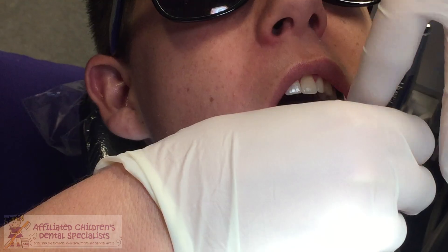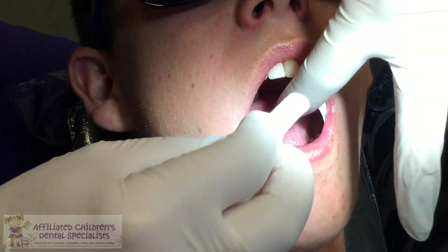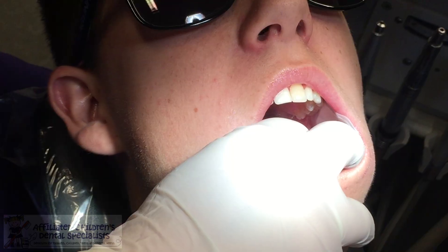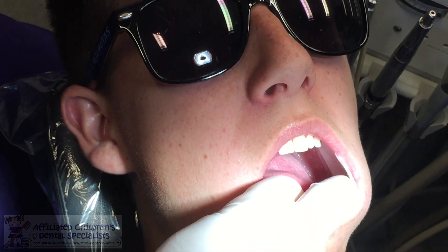Sherry, do you mind adjusting the light for me, please? We're going to put a cotton roll by your tongue. And I'm going to dry your teeth.